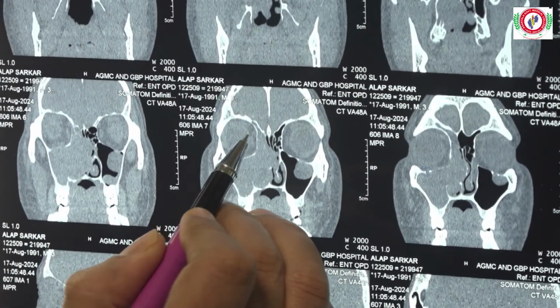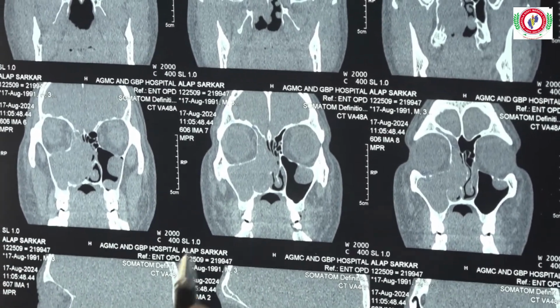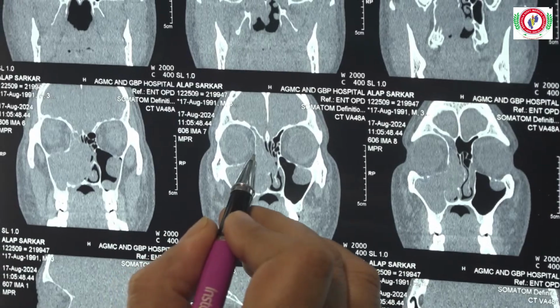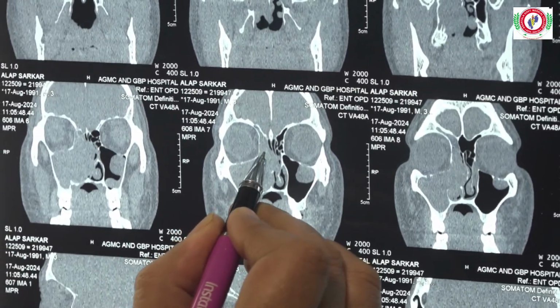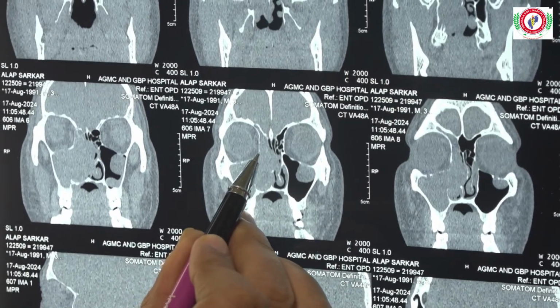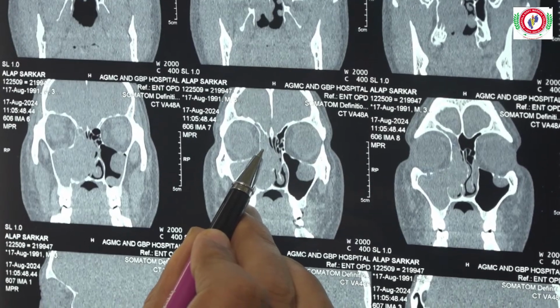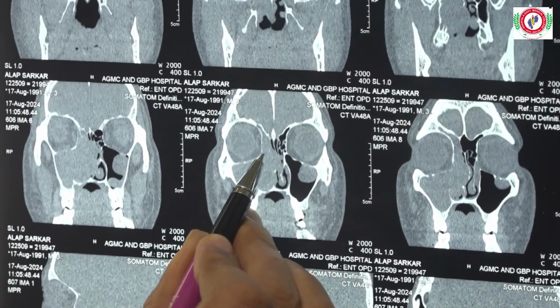So any pneumatization that extends supraorbital, that is posterior to the frontal sinus, is a supraorbital cell. It's as simple as that. This is a little small supraorbital pneumatization. It is a part of anterior ethmoid pneumatization only.